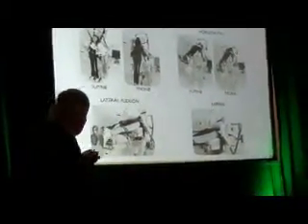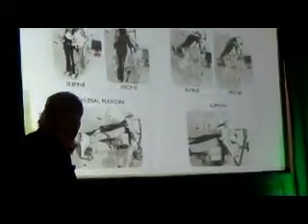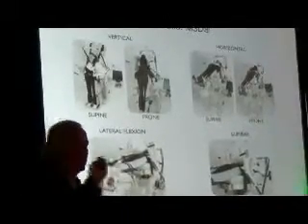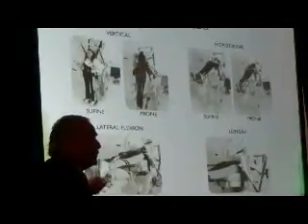So there are many positions that you can place a patient in, and you can do many of these things on any device that you have, right? Lateral flexion is very important. I find lateral flexion key. I find vertical positioning key. 50% of my patients, particularly older patients, I never put horizontal. There's no reason to challenge their chest, respiratory problems, or this gets them well, I stick with it, particularly in the prone position. Dynamite, plus the manual therapy you do with it, manual manipulation you do. Excellent.